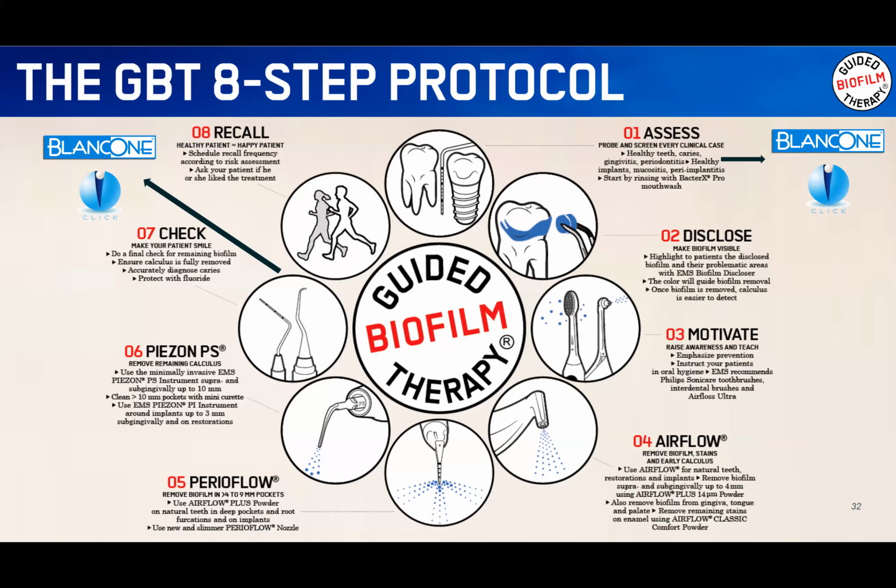And if we think that we can improve the aesthetics, and the aesthetics is part of the health definition from the World Health Organization, a good state of physical but mental health too, and this can improve the mental health of the patients. And just getting 2-3 shades lighter can be a really motivating aspect in the life of someone. So we can talk about it in the assessment, and then once we get to step 7, checking if there's calculus or not. If there's not, we can go to the click, because it takes only 10 minutes.